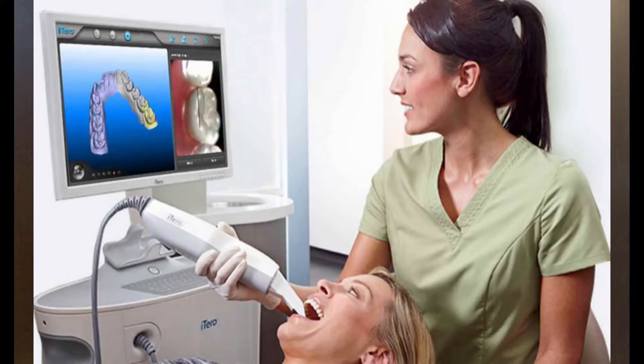This tool shows you the movement of your teeth on a tray-by-tray basis throughout your entire treatment using a 3D model. When you have impressions taken for your Invisalign — whether that's the physical putty impressions or the scanning tool — that's what your orthodontist sends off to Invisalign. Basically, they use a handheld device, have you open your mouth, and scan each tooth, taking a bunch of pictures all around. As she's doing that, it's putting a 3D model of your teeth onto the screen right next to the dentist chair in real time.